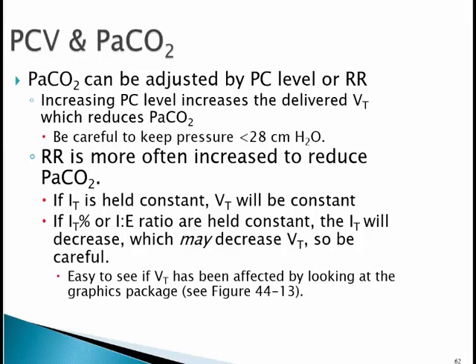But the CO2 can be adjusted by the pressure control level or the respiratory rate. Increasing the pressure control level increases the delivered tidal volume, which reduces the PaCO2. Be careful to keep the pressure less than 28. So again, we don't want to approach that 30 because that represents the plateau pressure. Respiratory rate is more often increased to reduce the PaCO2. If the I time is held constant, the tidal volume will be constant. If the I time percentage or the I ratio is held constant, then the I time will decrease, which may decrease the tidal volume, so be careful.